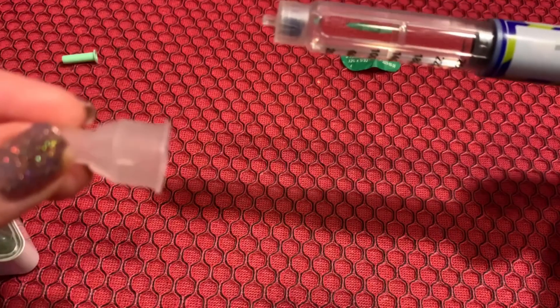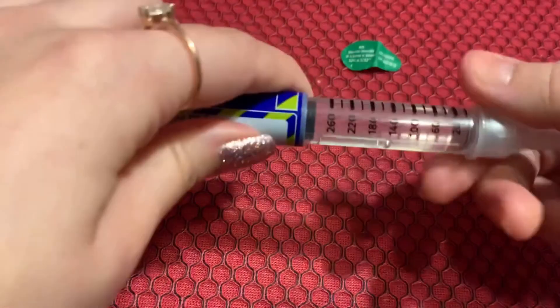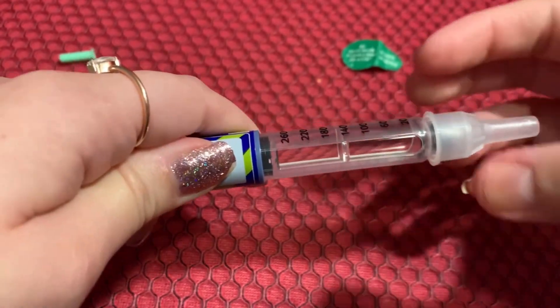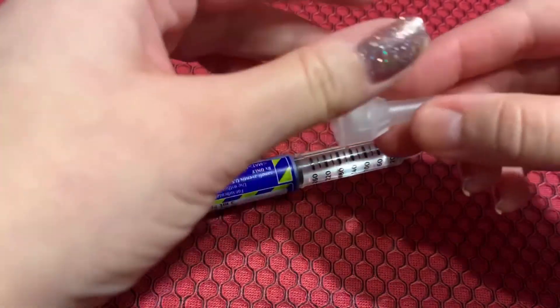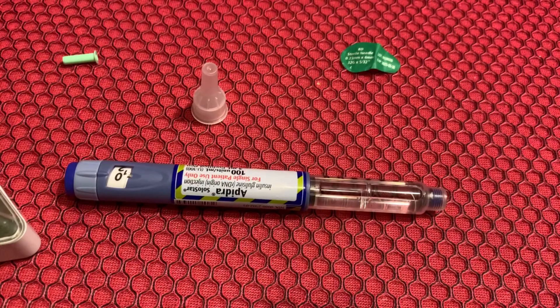Then pull straight out just like you came in. Take that clear cap you saved and put it back on the needle, then turn the opposite direction — lefty-loosey, counterclockwise — and wiggle it off. It's a little easier than taking the needle off bare. Dispose of the needle in a sharps container. And that's how you give yourself an insulin injection with an insulin pen. Go to my website at www.givemesomesugar.coach.com/insulin-pen to download the free PDF guide with all of these step-by-step instructions.